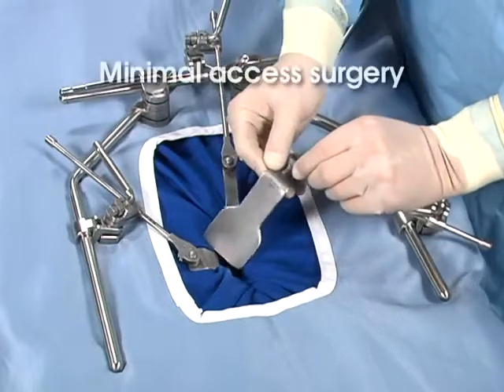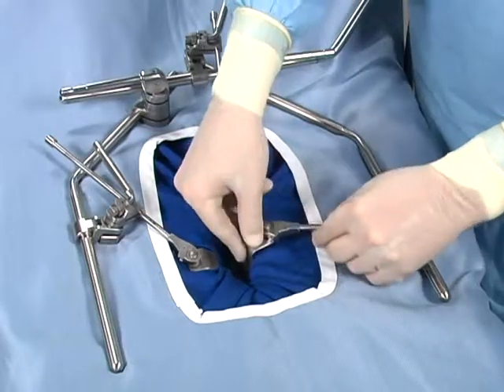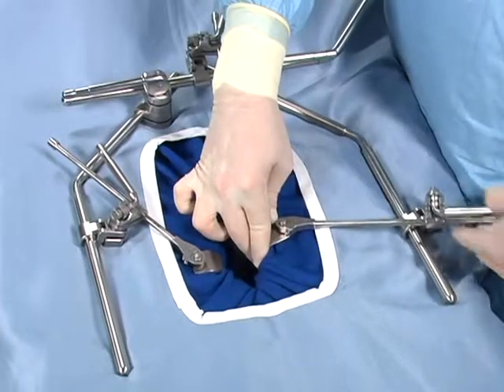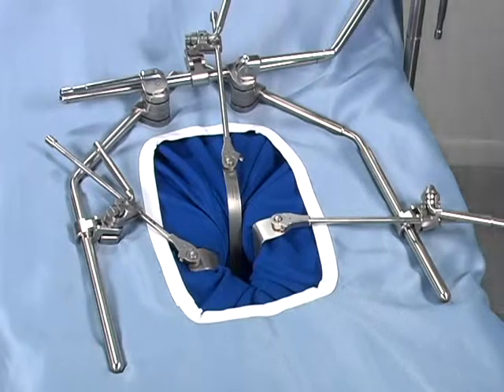Minimal access surgery — when the incision is smaller than has traditionally been the case — can be accomplished with the Thompson retractor. Small and modified retractor blades are utilized to gain the required exposure and visibility through a small incision.